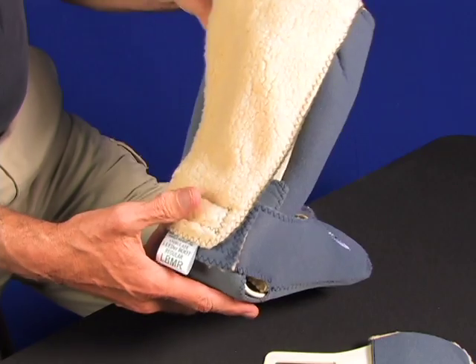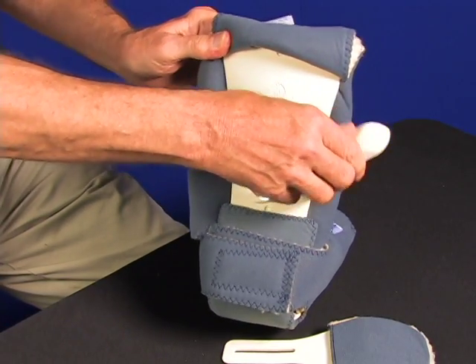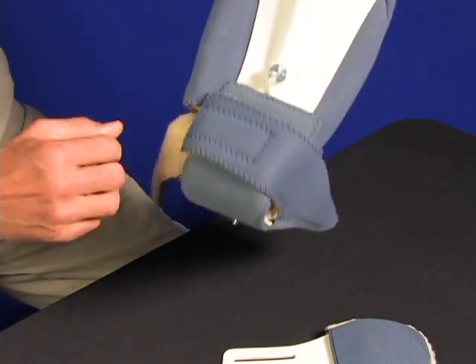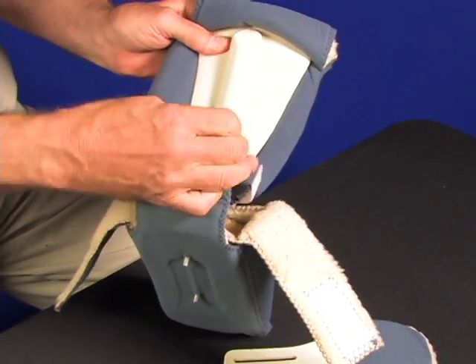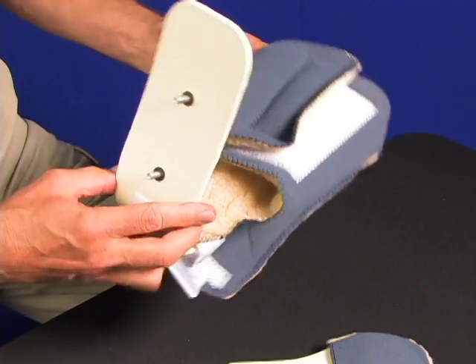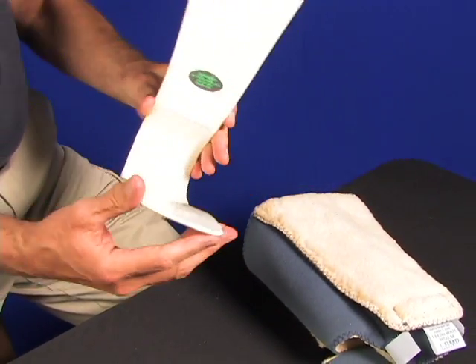Remove the toe post. Now turn the boot back up and around to the back. Lift the back cover up and note how to adjust the anti-rotation bar — it locks in place right or left 90 degrees. Open the large Velcro tabs at the back of the boot; the bottom cover is held in place here. Open the small Velcro tabs from the top cover. Pull the tongue back that covers the back of the shell and slide the bottom cover off. The top cover is still in place, held with Velcro — it engages with the Velcro on both sides of the shell. Just pull the cover back from the shell and it will slide off the top.